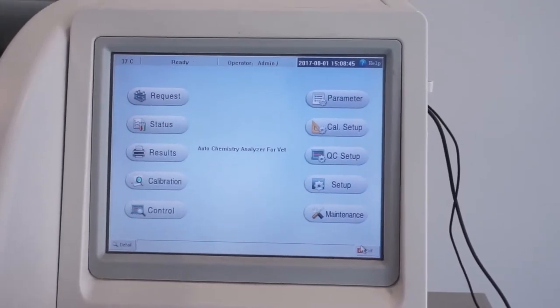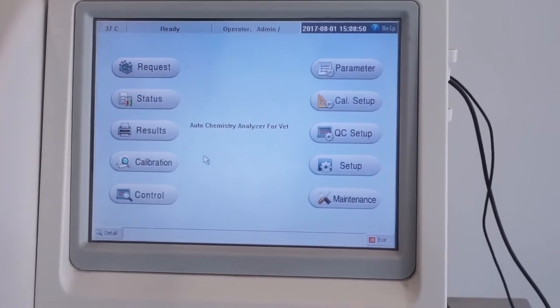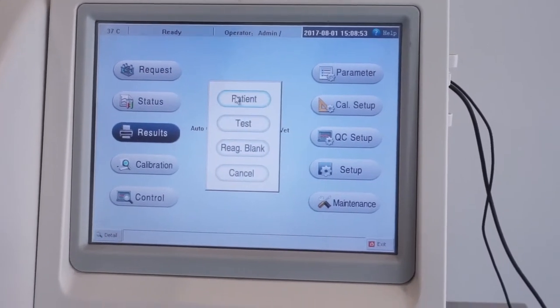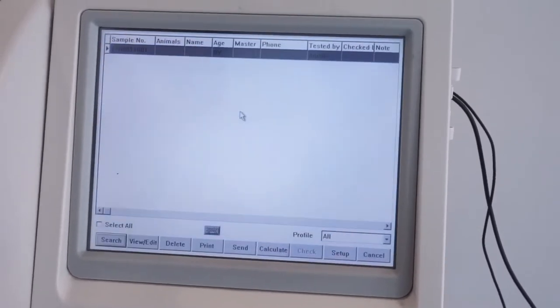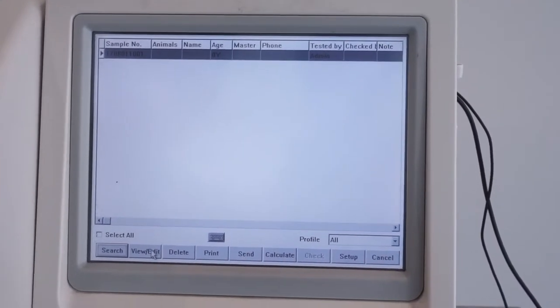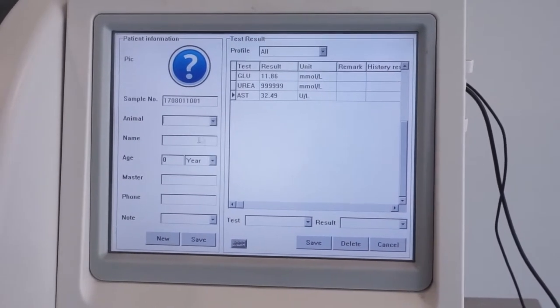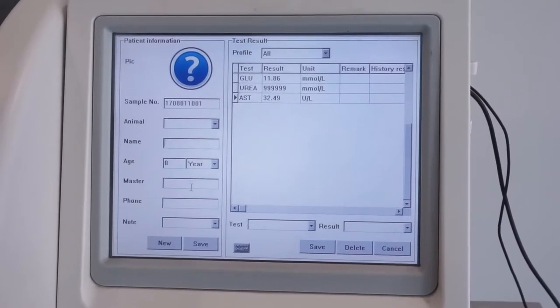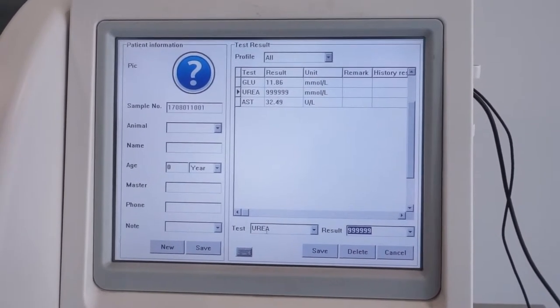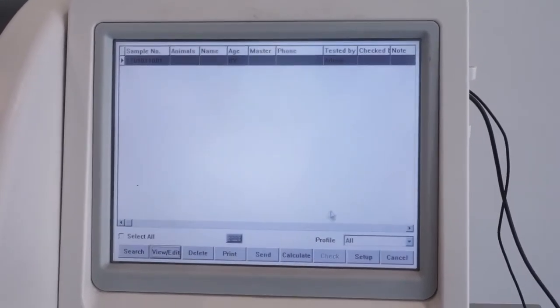Okay, after the machine finishes the test, I want to introduce another button of the main screen. As we can see, this is the result, and we have a patient result, a test result. You can go to here to print or to send, no problem. You can also edit the information. You put the animal, the name, the master, the phone number and notes. And then you can go to here to edit the results. Also you can delete.